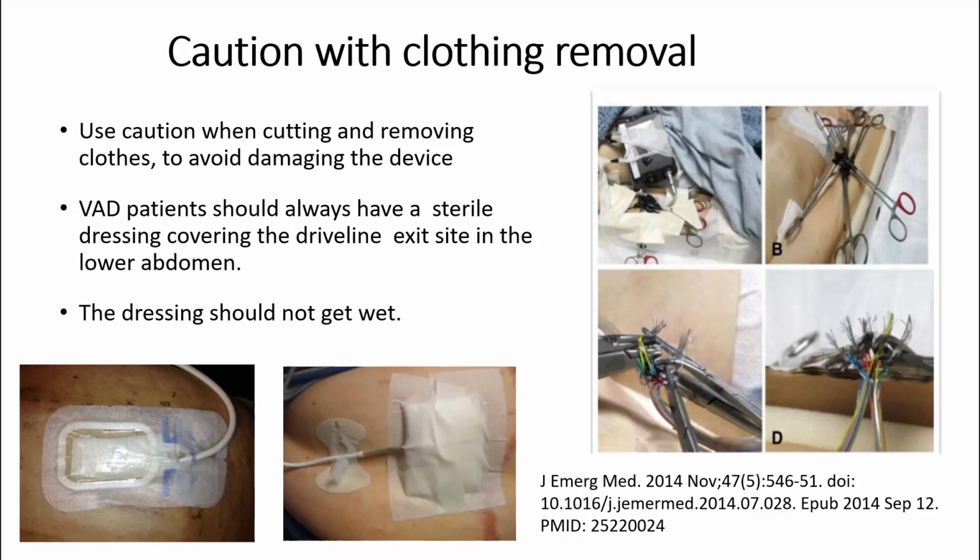For the medics in here, they also gave him fluids, and they did vasopressor infusions. We'll talk about that in a minute. So that's foreshadowing. But they did fluids, they did vasopressor infusions, and they did CPR. Everybody's worried about CPR tearing up the LVAD. There's not any real evidence of that. I won't say it's not a risk, but it's a low risk compared to being in full cardiac arrest with the pump not working at all. They're essentially in arrest. The concern is you'd be doing CPR, of course, and the pump was working. In this case, the pump wasn't working.